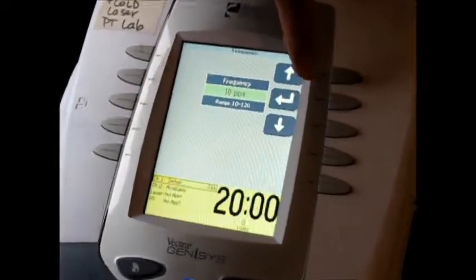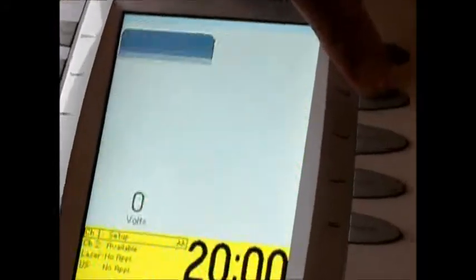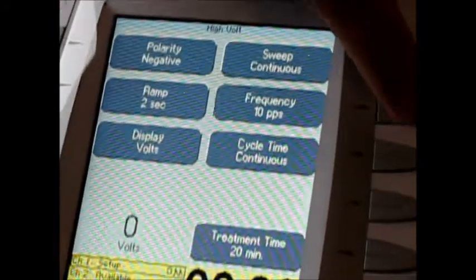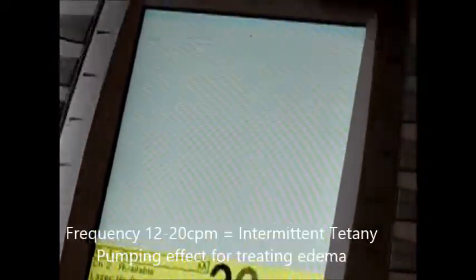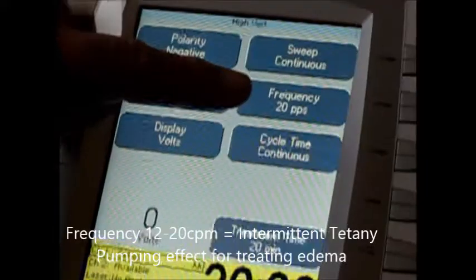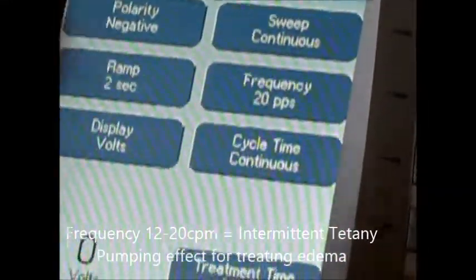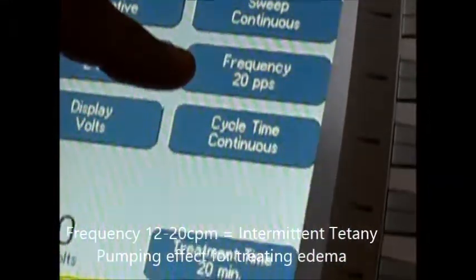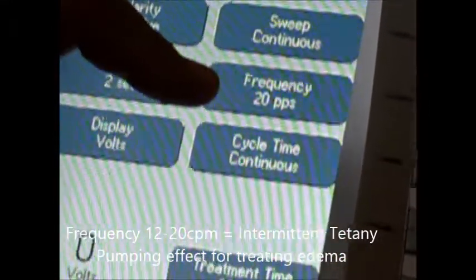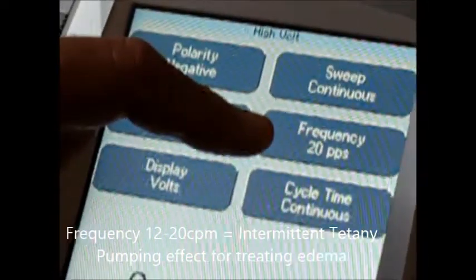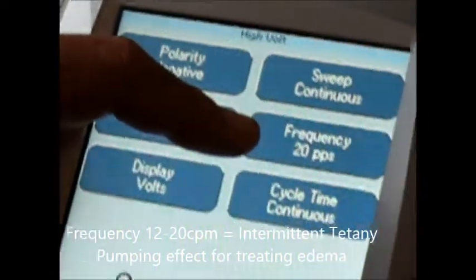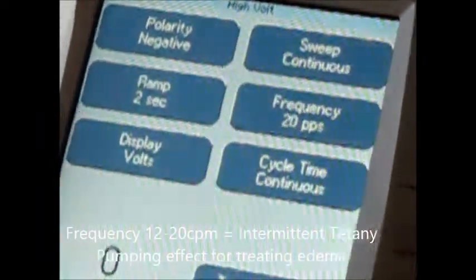The next frequency is going to be 20 pulses per second, or hertz. This time the person will pulse even faster. This one is going to be called intermittent tetany, and it is good for pumping out edema. It causes a vigorous contraction and it pumps out the edema.